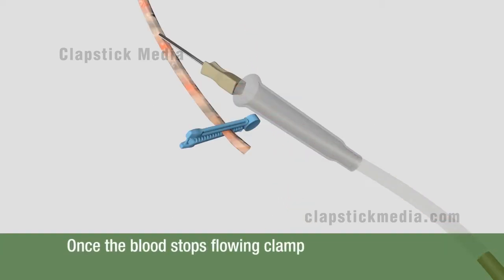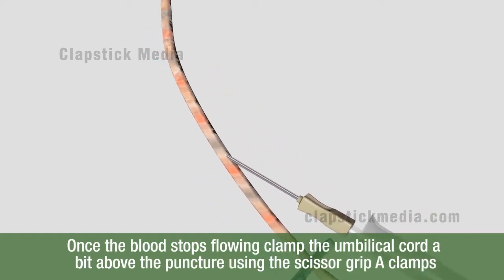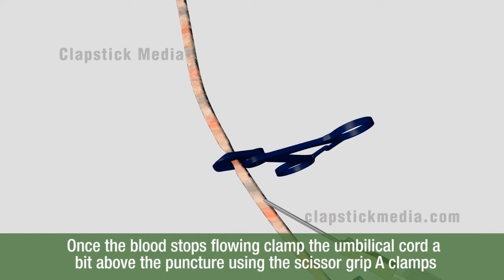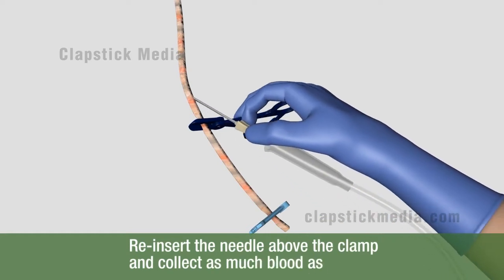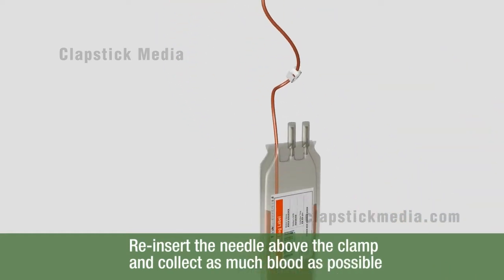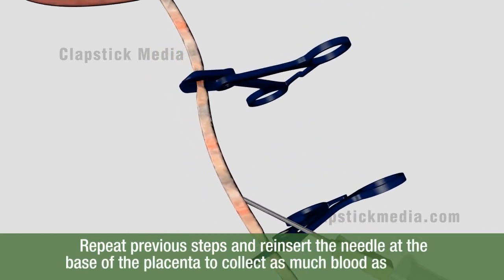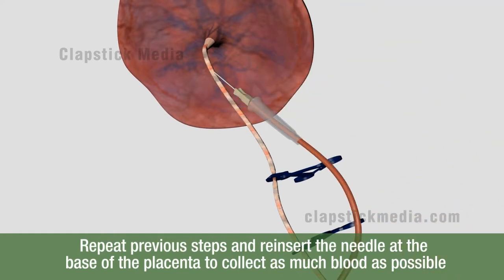Once the blood stops flowing, clamp the umbilical cord a bit above the puncture using the scissor grip A-clamps provided in the kit. Reinsert the needle above the clamp and collect as much blood as possible. Once the blood flow stops at this location, repeat the above steps and reinsert the needle at the base of the placenta to collect as much blood as possible.